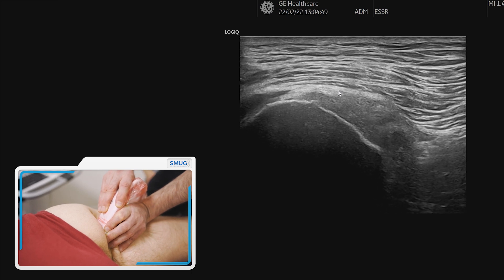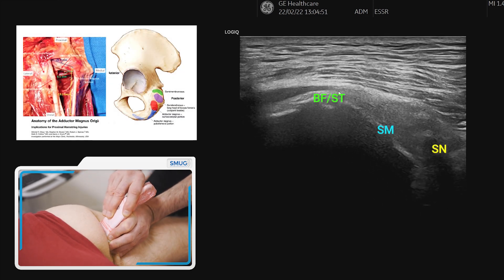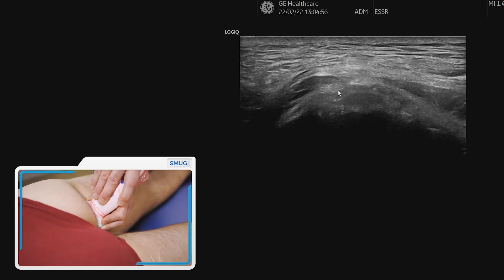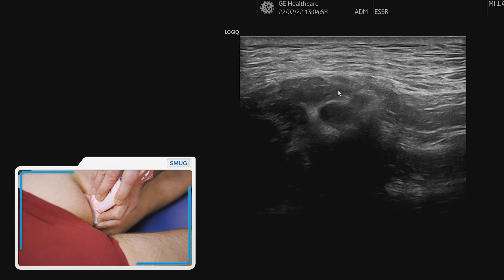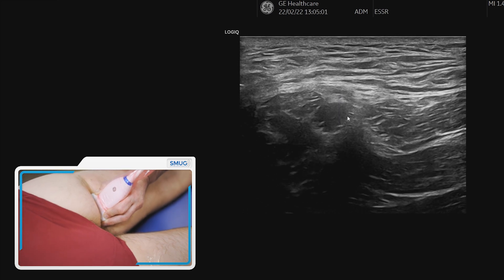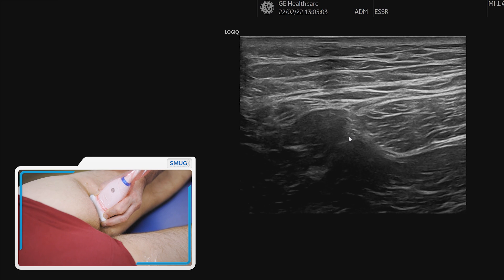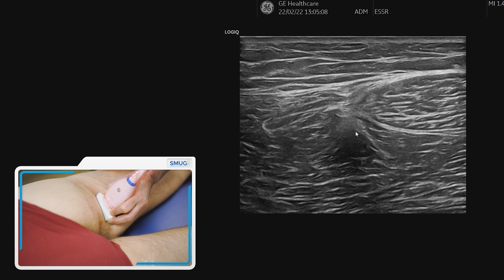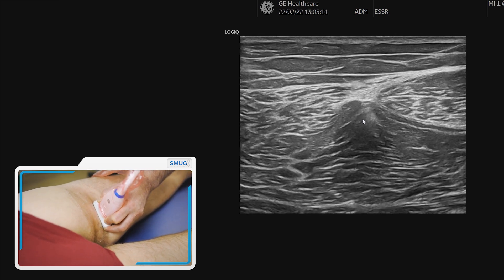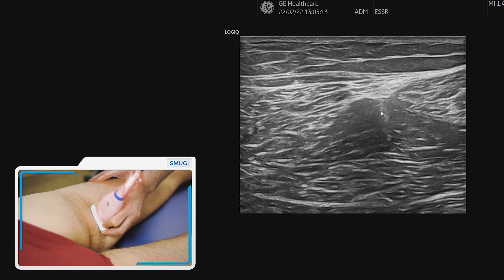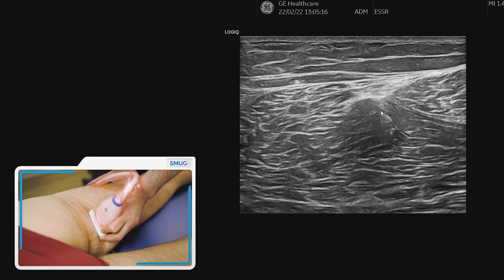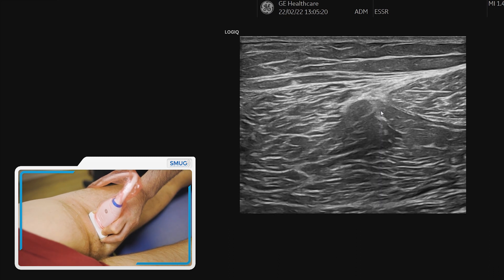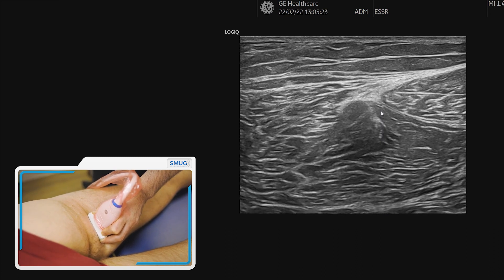Moving lateral from the adductor magnus attachment, we're back onto the hamstring attachment itself — you can see they're not that far removed from each other. Tracing back to where we started, that little tendon just visible deep to the semitendinosus muscle is your starting point. That is the approach for the proximal assessment of the adductor magnus tendon, as well as the landmarks for the proximal hamstring.